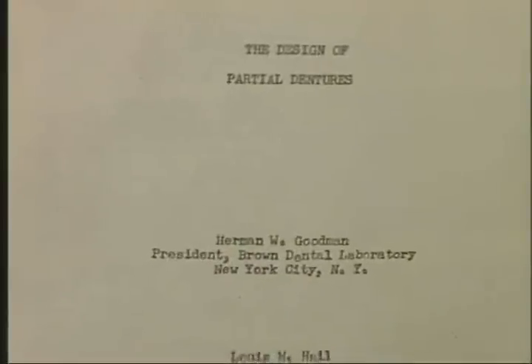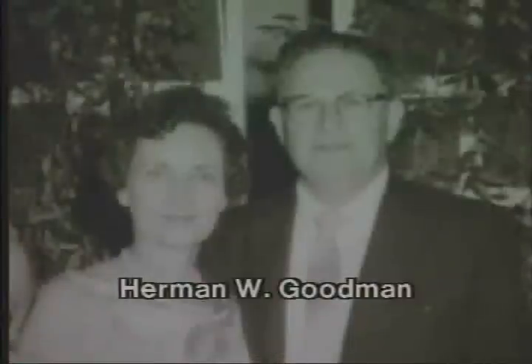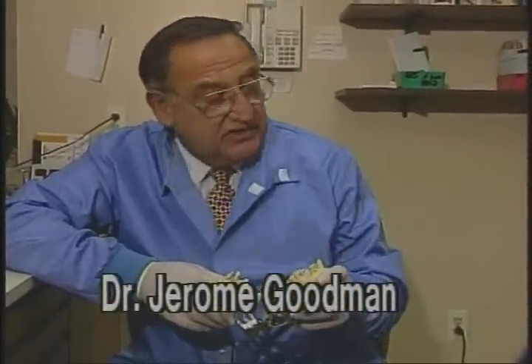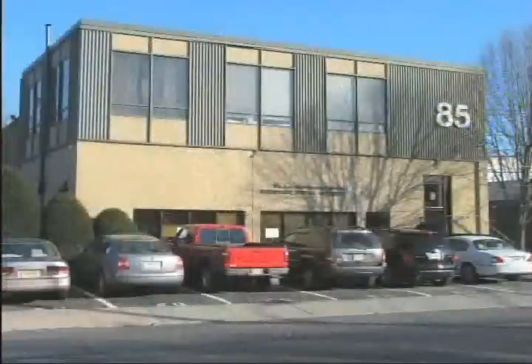The Equipoise system of removable partial dentures, using the basic laws of physics, was first introduced by Herman W. Goodman in 1946. It was further developed into a complete system by his son, Dr. Jerome Goodman, who, with his son Michael Goodman, own and operate the Equipoise Institute.